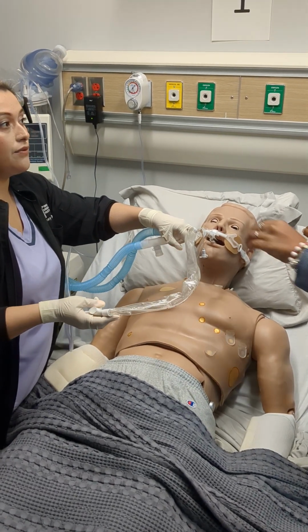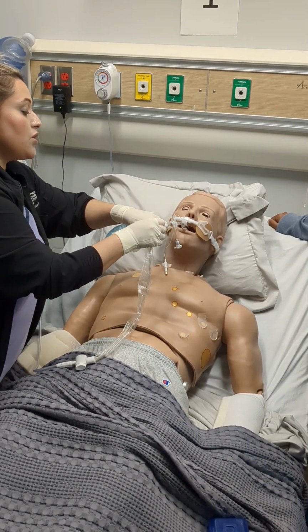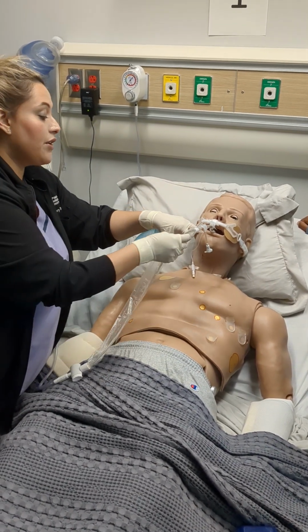Okay. I have a question. What is your left hand doing? Yeah, stabilizing the endotracheal tube. You shouldn't leave it all the way out. Like if you leave it all the way out, this is gonna become inflated and it's gonna create like a little leak.